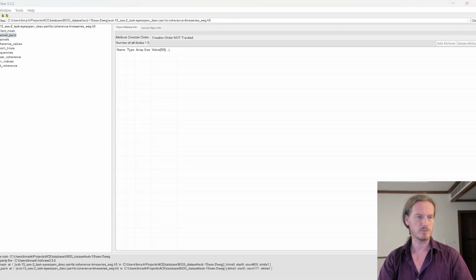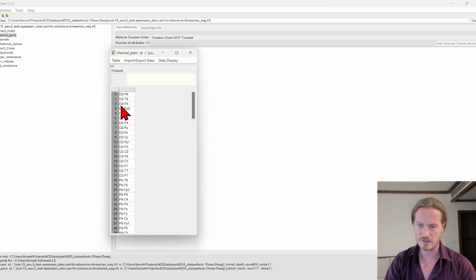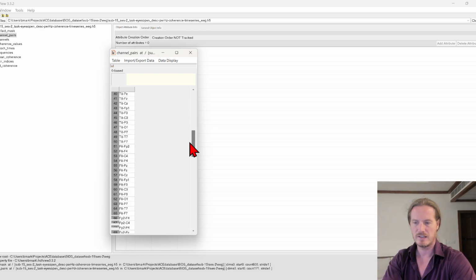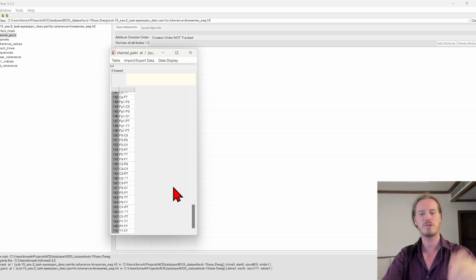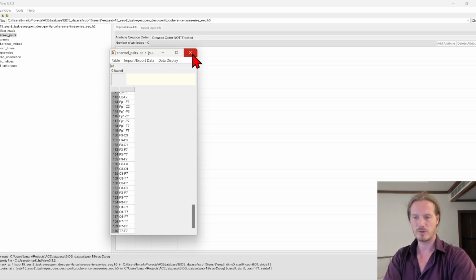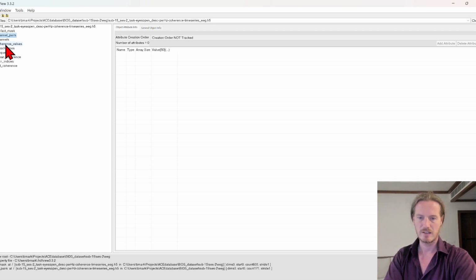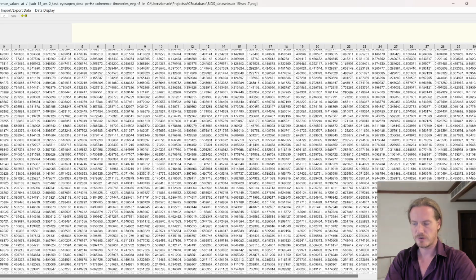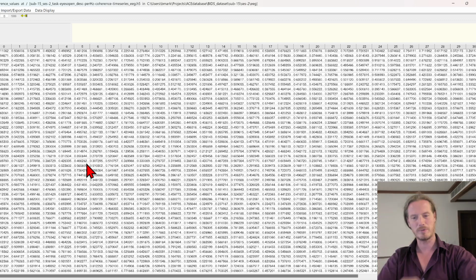So that data is here. Then we have the channel pairs, and this will tell us that the first thing to appear is channel O2 and P8, and O2 and T8, and O2 and F8, etc. We have 19 channels, 19 positions that we measure on the head, and that gives us 171 different combinations of coherence. So this one with this one, and this one with this one. That's 171 possibilities of coherence, and they all get recorded and saved in this time series H5 file. And if we look at this chart over here, this is kind of the big one. Down here we have 171, so the rows correspond to all of the possible coherence pair combinations.